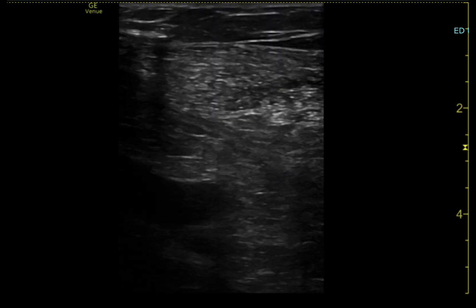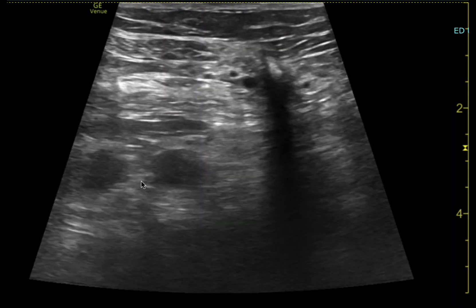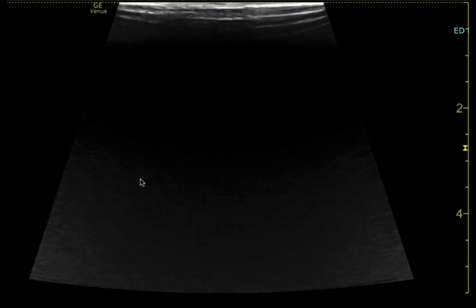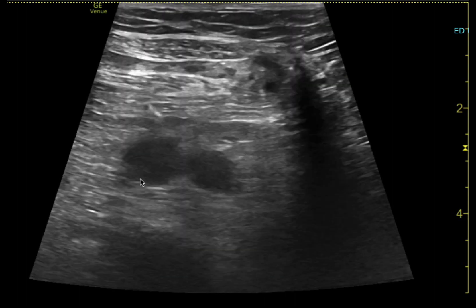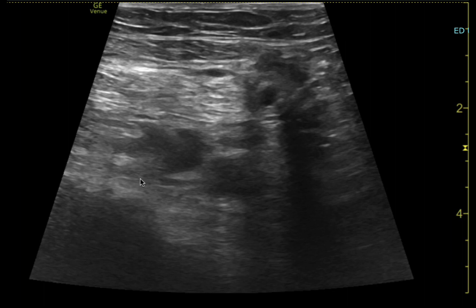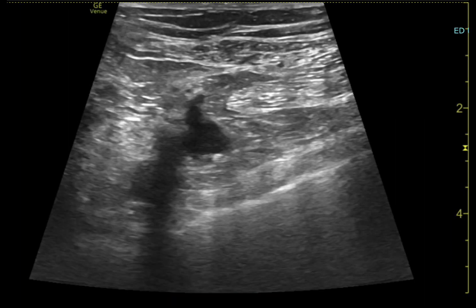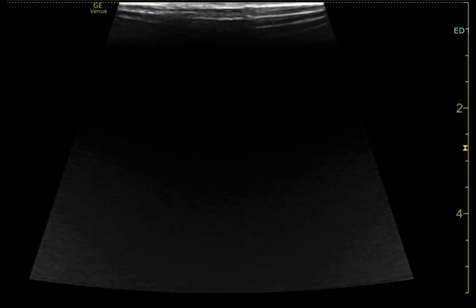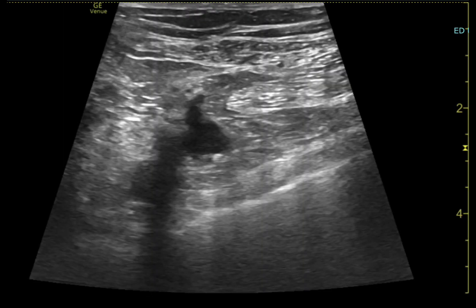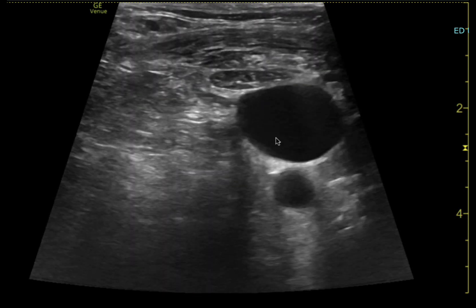I'll identify the vessel, make sure I line it up, and then go get all my supplies and prep sterile — all the things we usually do. In this particular case I didn't capture images of the needle puncturing the vein, but you can see me following the wire to make sure it goes where I want. Here's the wire — it tracks into the vein.